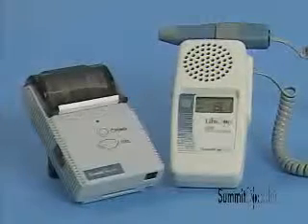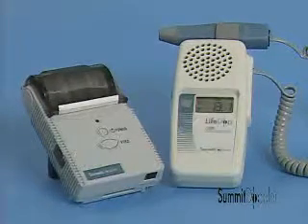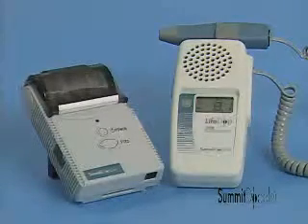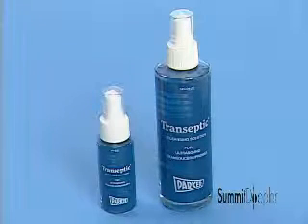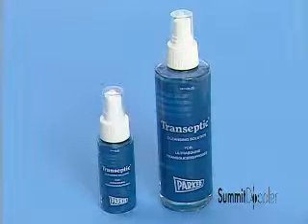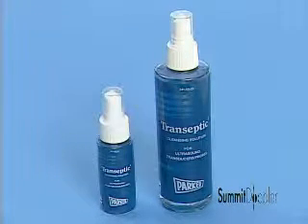The following section includes information on the care and maintenance of your LifeDop 250 ABI system. Always refer to the user's manual for complete information. Clean your LifeDop system periodically using Transeptic or another alcohol-based agent. Summit Doppler Systems recommends against using cleaning agents with detergents since they may eventually degrade plastics.